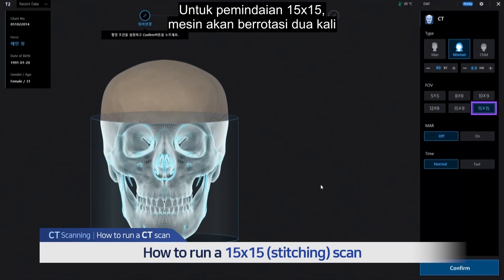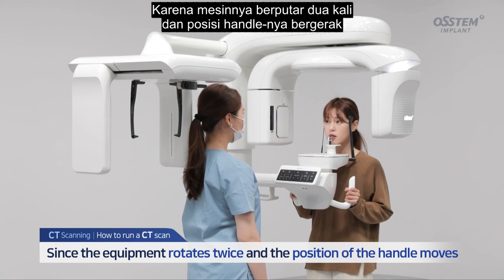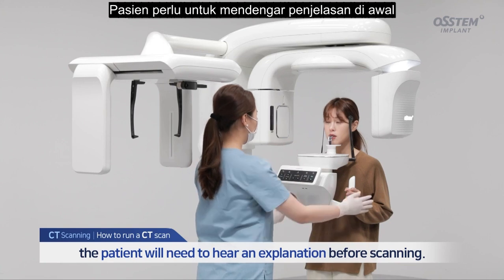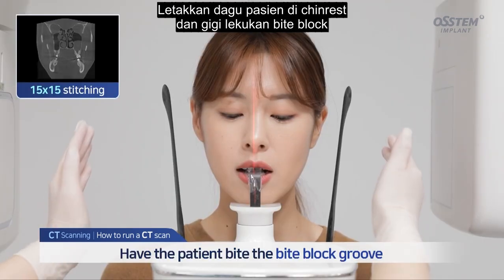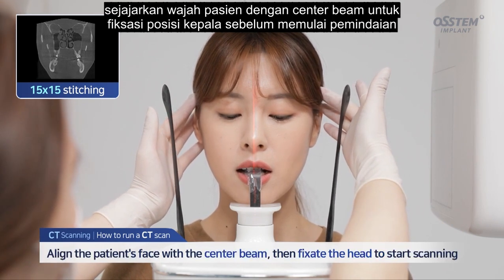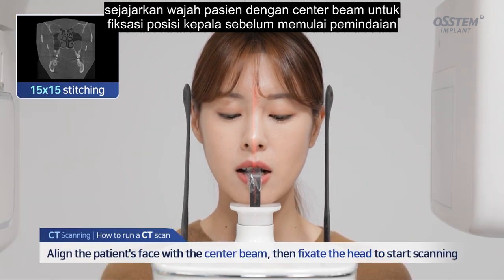For the 15x15 scanning, the equipment rotates twice. Since the equipment rotates twice and the position of the handle moves, the patient will need to hear an explanation before scanning. Have the patient rest his/her chin, and bite the bite block groove. Align the patient's face with the center beam, then fixate the head to start scanning.